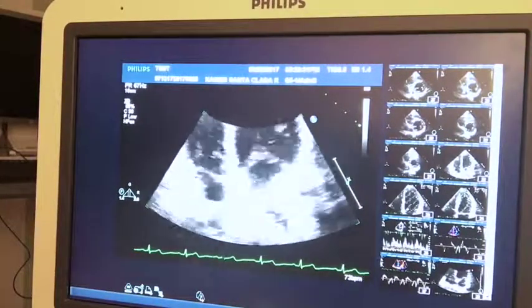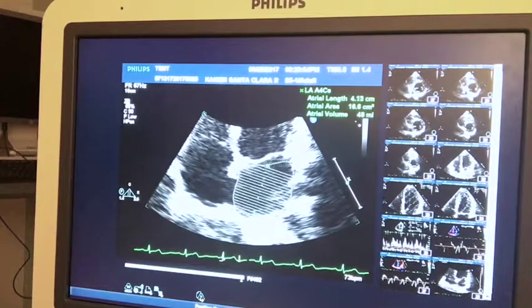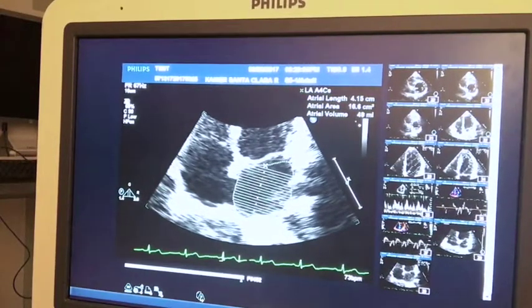And then the next thing is I'm going to go to a zoomed picture of the left atrium. And when I'm doing this, as I'm tracing out the left atrium, I want to start on the far wall, on the distal wall. And also I don't want to include all of the atrial space, because the mitral valve can be inappropriately added to the volume. Okay, so I want to make sure that I'm going from annulus to annulus on the screen.